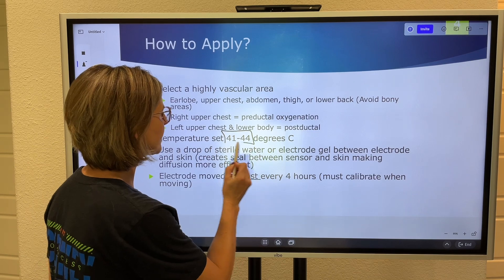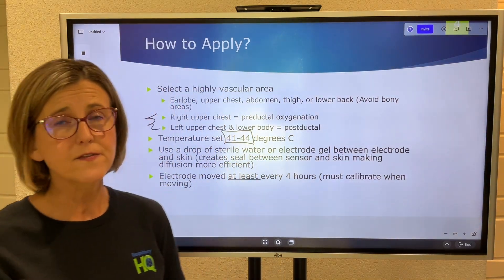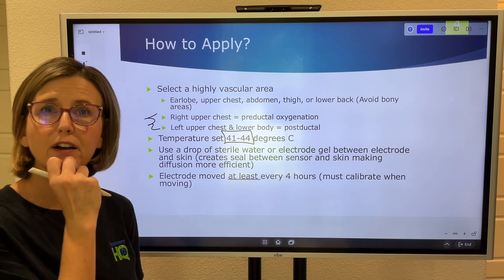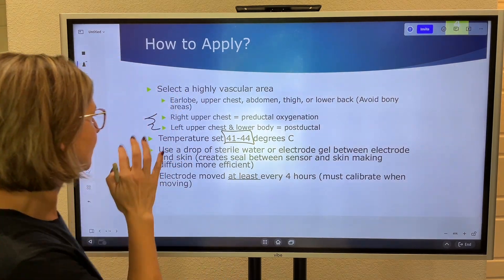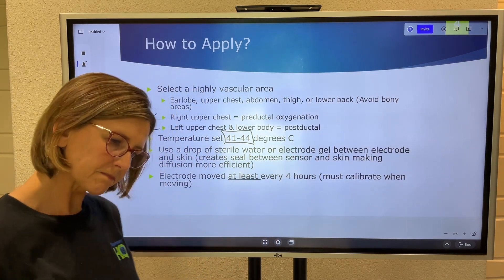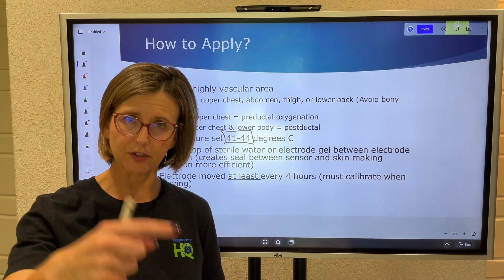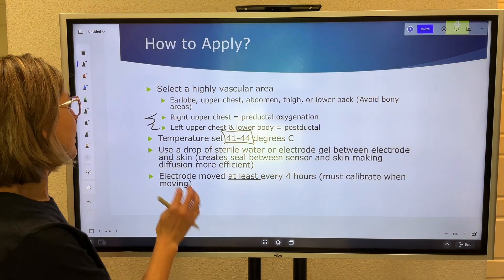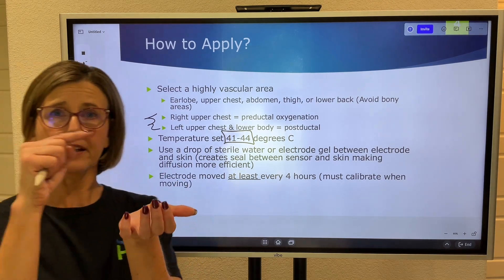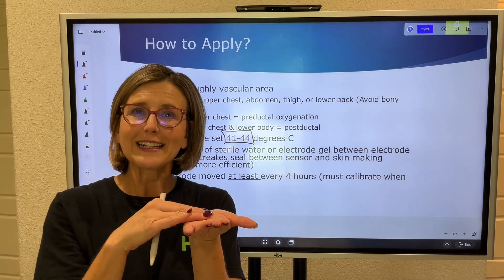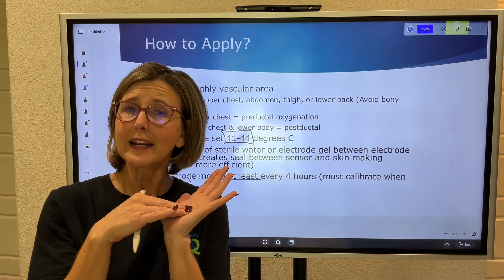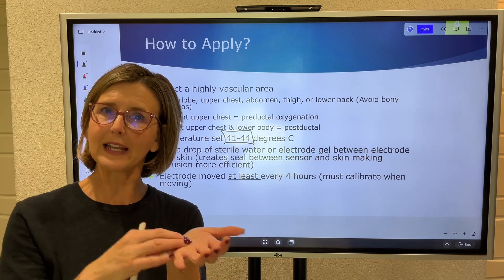The temperature needs to be set between 41 to 44 degrees Celsius — per Walsh's Neonatal and Pediatric reference, 42 to 44°C. Anything colder won't produce good vasodilation; anything hotter risks burns. You also apply a drop of sterile water or electrode gel between the electrode and the skin to create a tight seal, making diffusion more efficient and eliminating any air bubbles — you only want to measure gases from the tissues, not from an air bubble.